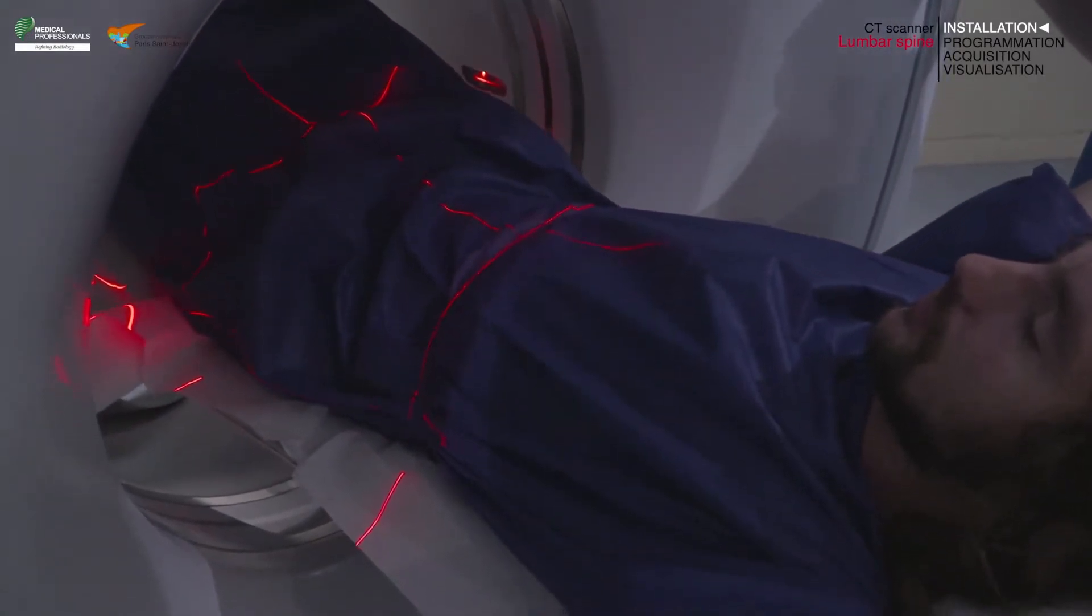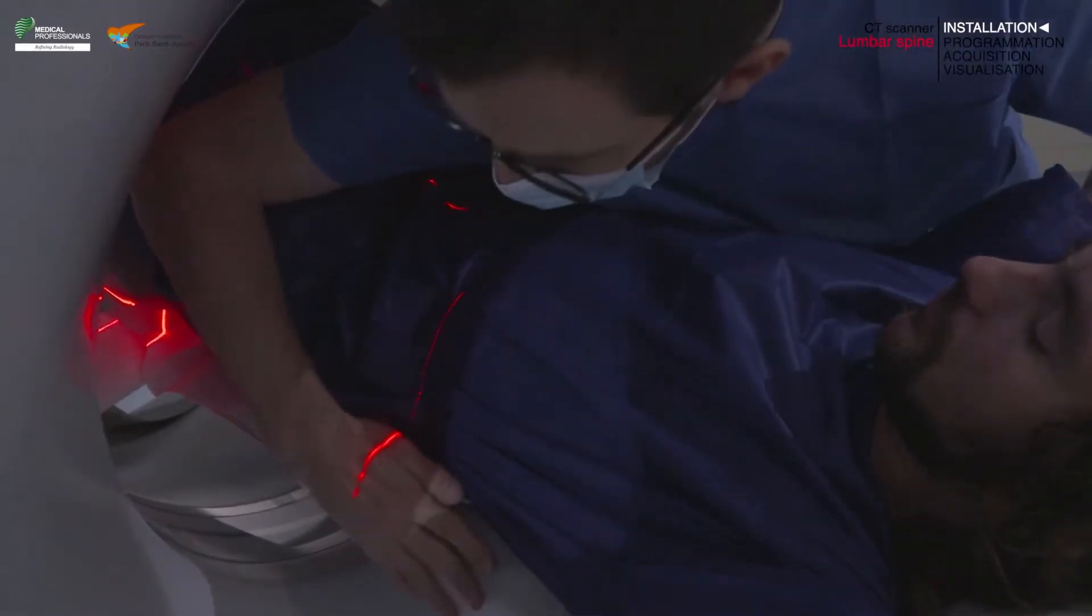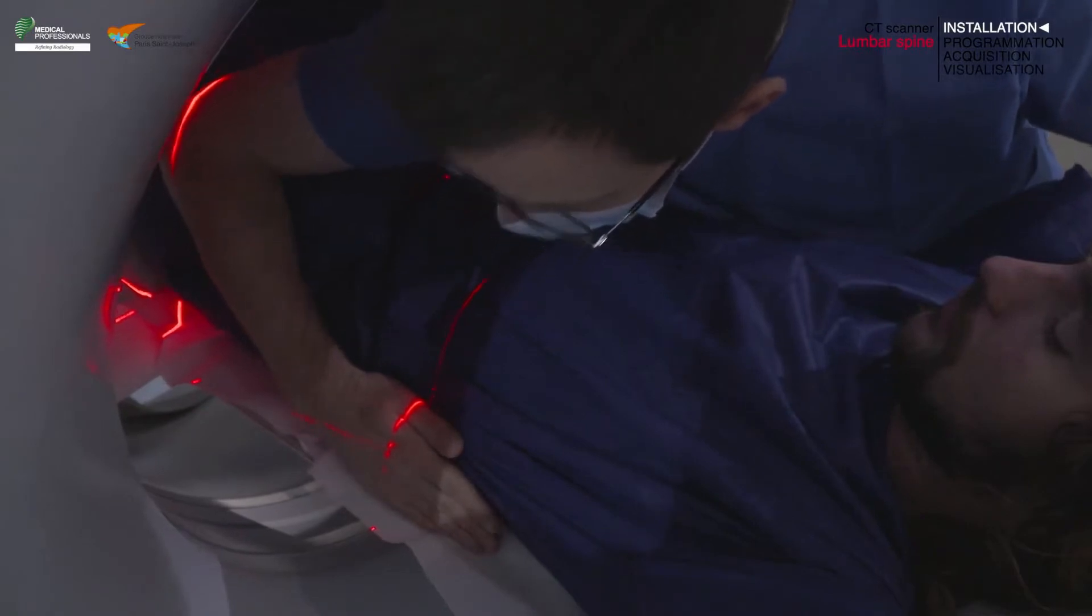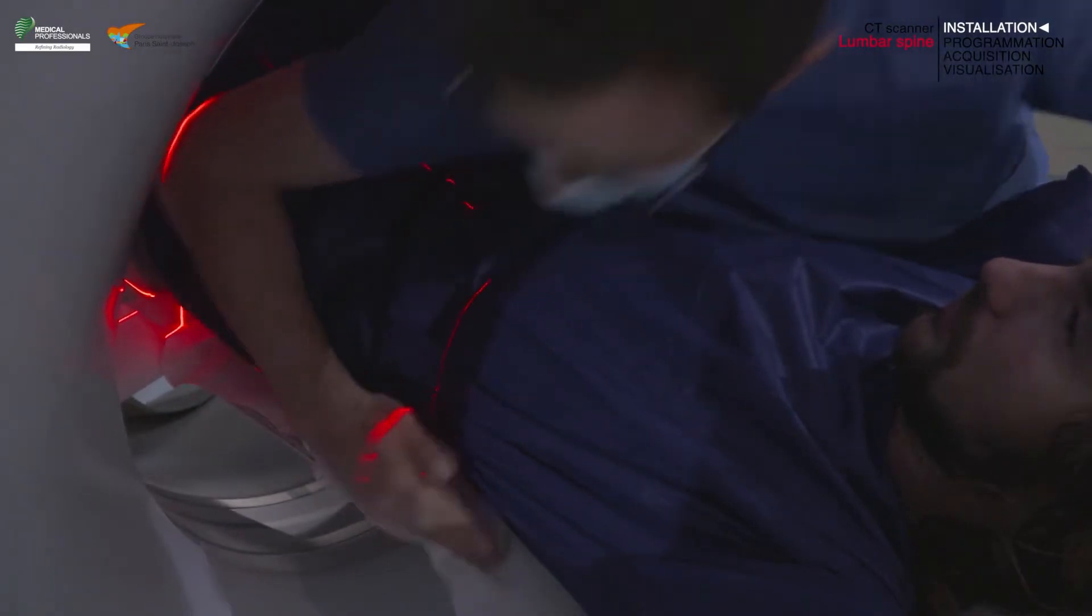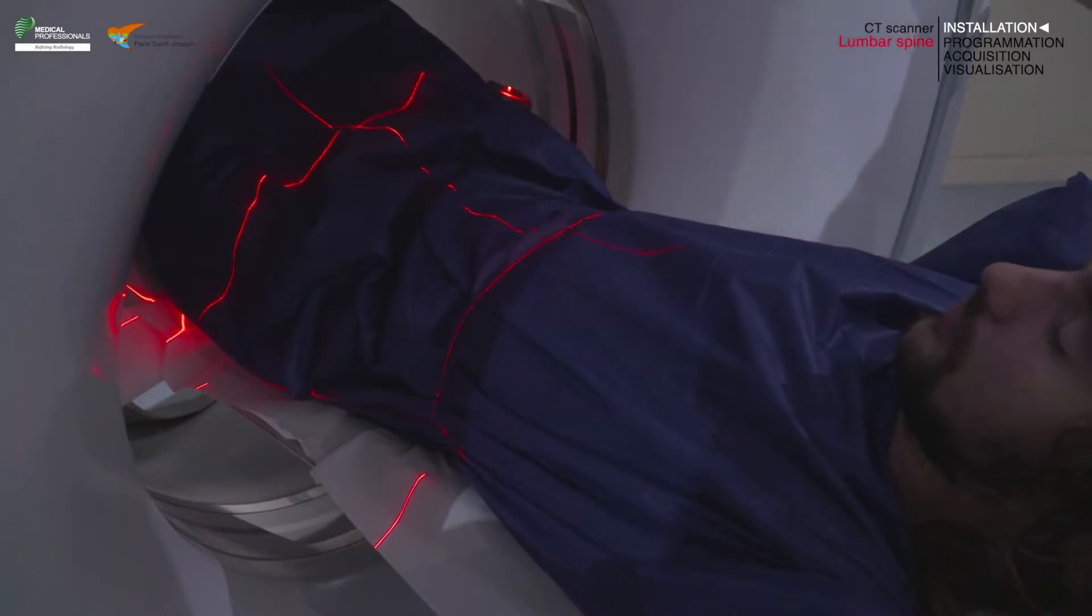Make sure that the lateral laser light is at the mid-thickness of the lumbar spine. Note that this is not the mid-coronal plane. Make sure that the longitudinal laser light is placed on the median sagittal plane.